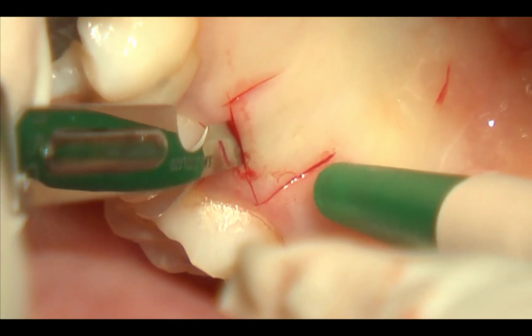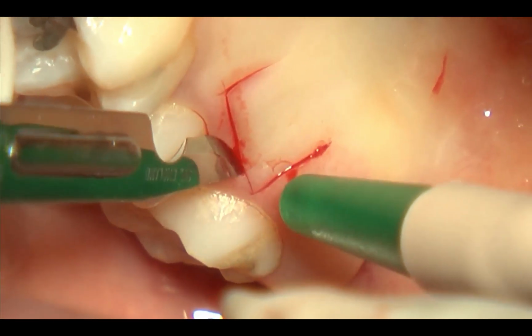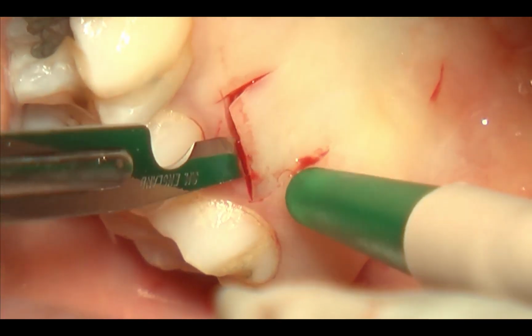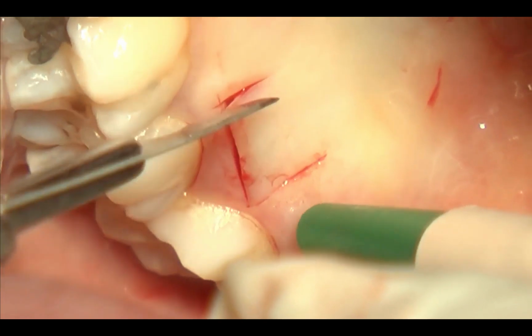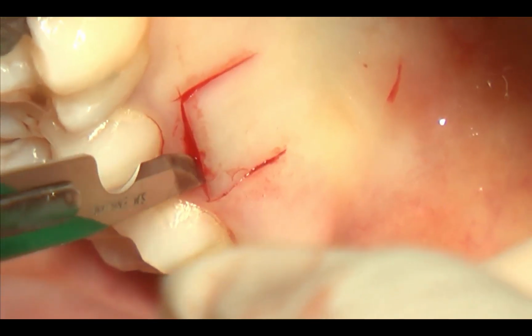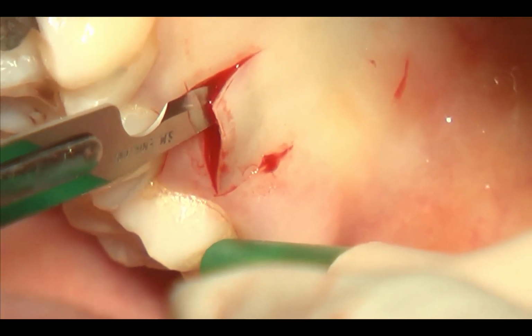Then we continue perpendicular and rotation, perpendicular rotation, perpendicular rotation, in order to give the graft the same thickness along the mesial vertical releasing incision.